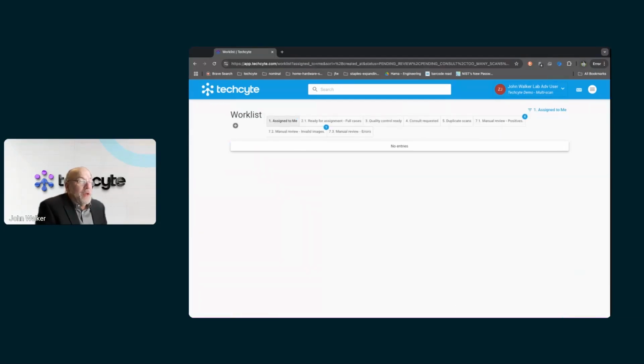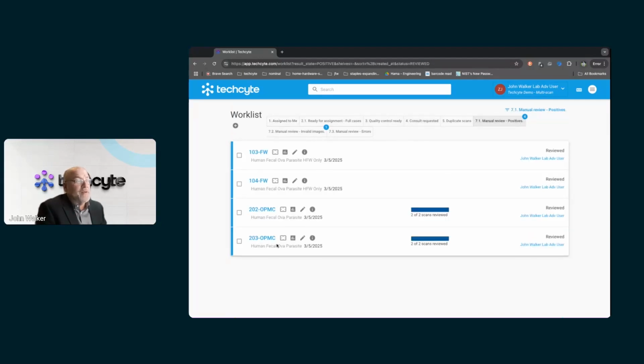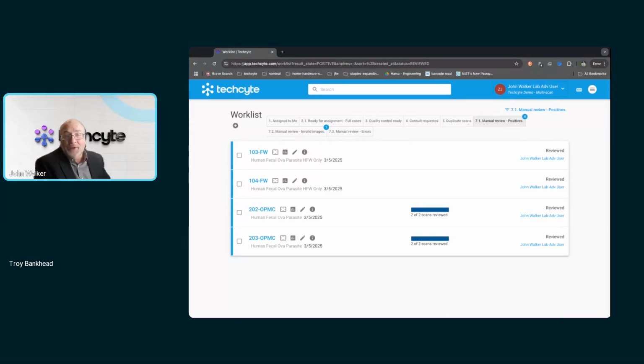Because that was all of the work that I'd assigned to myself, my assigned to me entity, it took me back to the work list so that if there was more work to do, I could assign it to myself. Otherwise, it's time to go to my list of reviews that were positive and pull those for manual reads. That concludes the demo. Thank you all.